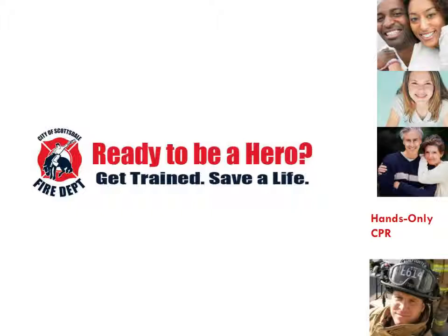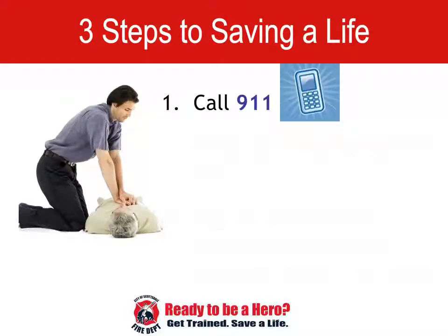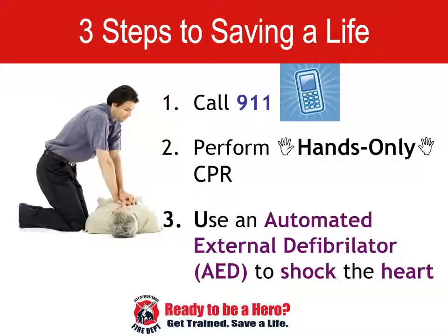In that case, we take 3 steps to save their life. The first step is to call 911, get the emergency responders on the way. The second step is to administer hands-only CPR. The third step, if it is available, is to use an Automated External Defibrillator or AED. Think of the AED as the cherry on top.